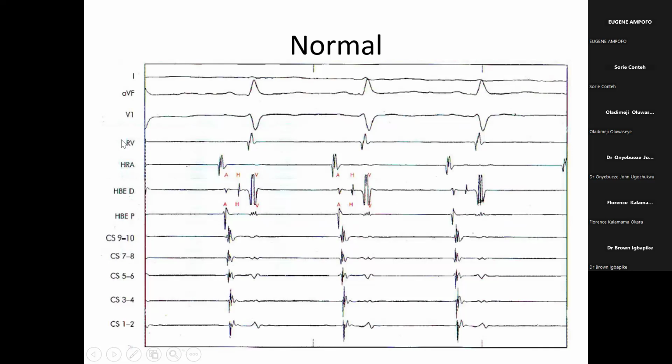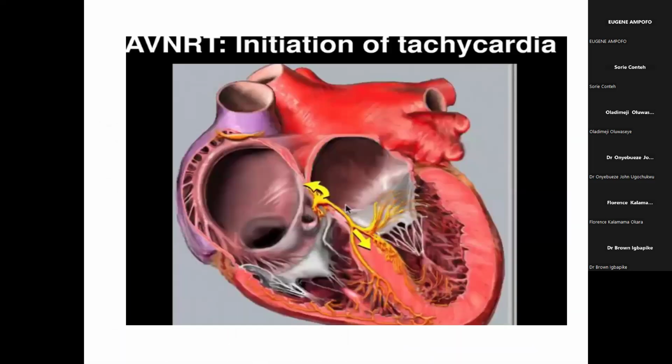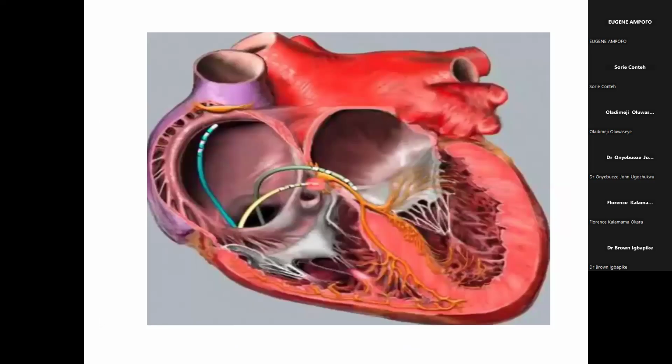There's something I want to bring to your attention very sharply: these catheters are always numbered. Some are bipolar, some are decapolar, some are octopolar.